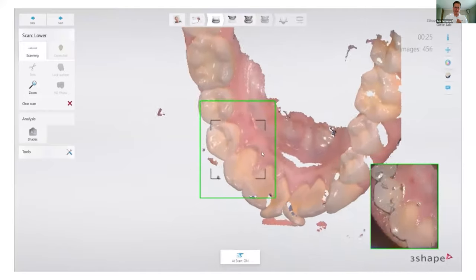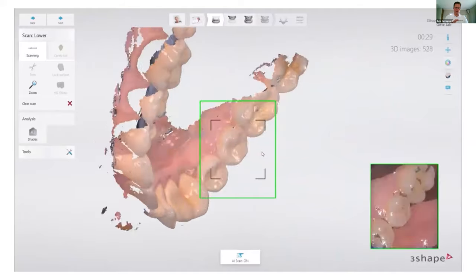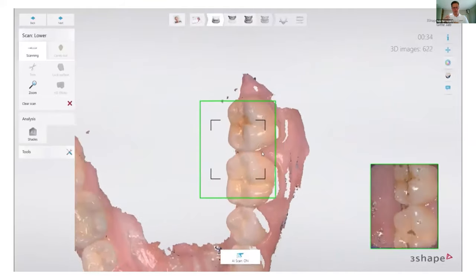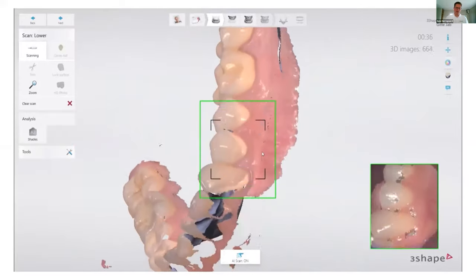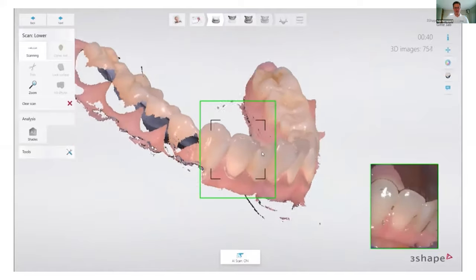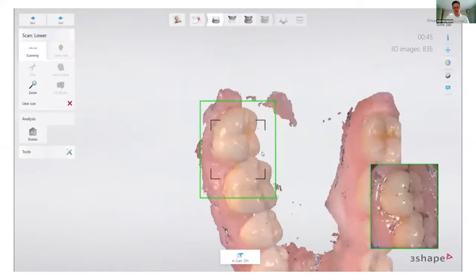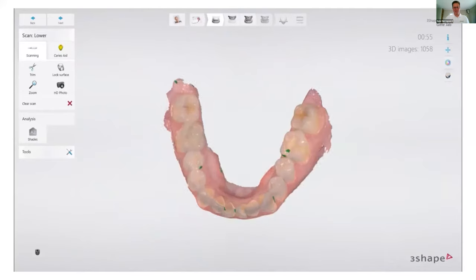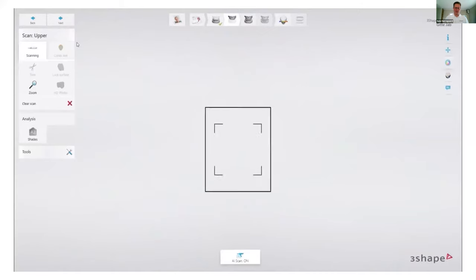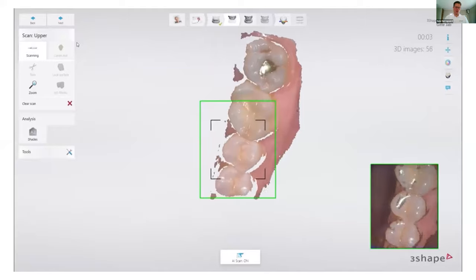So now we are scanning on the lingual side, that's on the inside of the teeth. We do that first after we've done an occlusal scan, and that's because the tongue is in the way. The tongue is a strong muscle, and it has a tendency to want to push the scanner away. So that's why you always scan the lingual side first, and then you go to the outer side of the teeth. For those that are not in dental terms, it's the buccal side or the facial side of the teeth. And then we scan the upper, and the process is more or less the same.